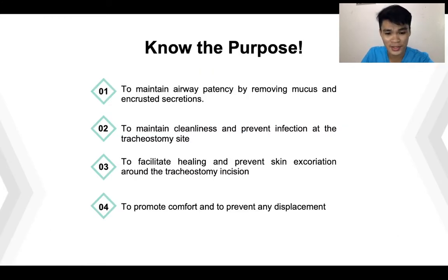Know the purpose. First reason is to maintain airway patency by removing the mucus and encrusted secretions. Second is to maintain cleanliness and prevent possible infection at the tracheostomy site. Third, to facilitate healing and prevent skin excoriation around the tracheostomy incision. And fourth, to promote comfort and prevent any displacement.